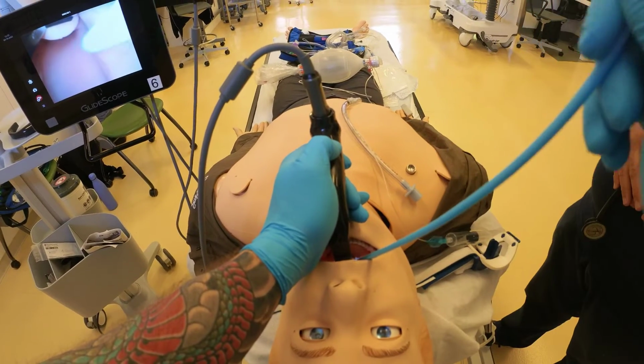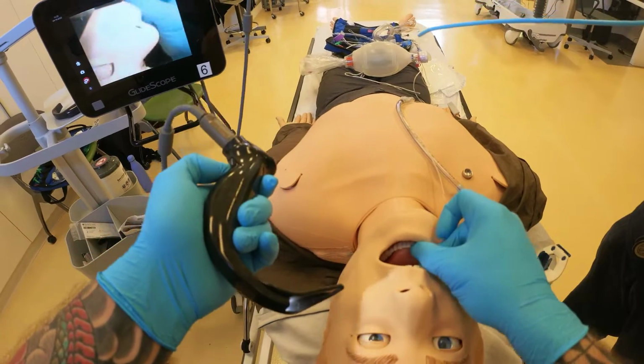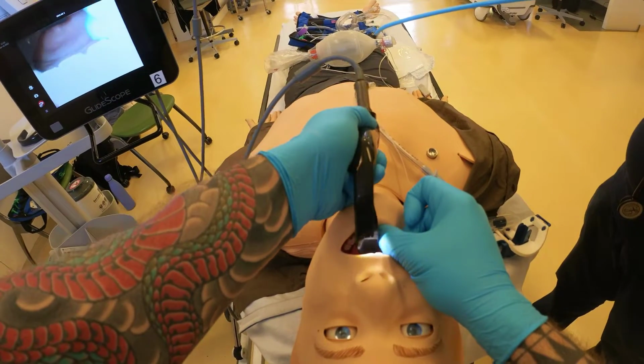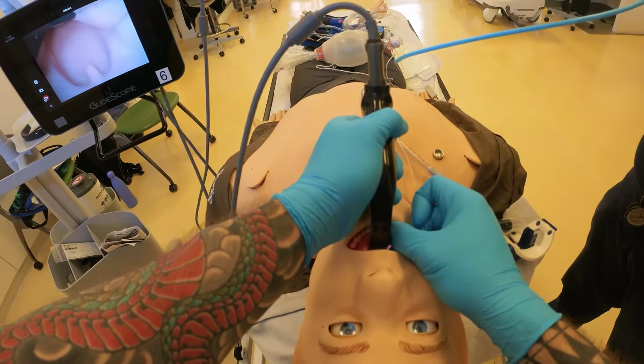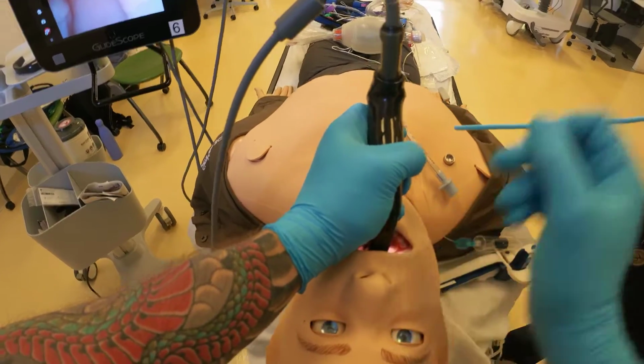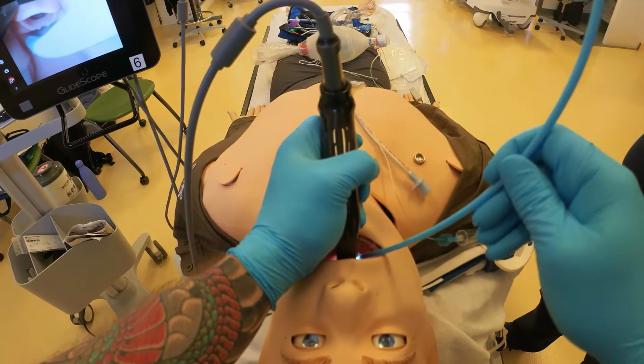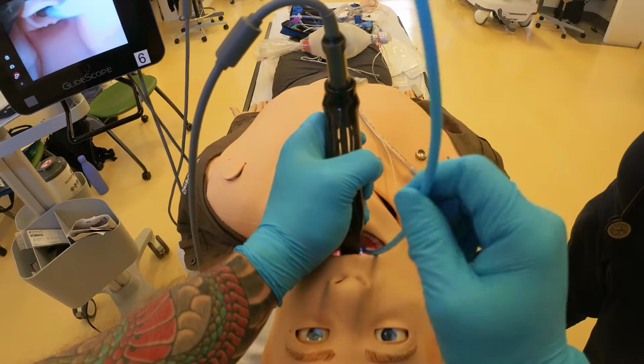So how this procedure looks from the beginning. So hold this for a second, right? Cross finger technique, right? Uvula, see it. Epiglottis is next. Set it into hyoepiglottic ligament. I see my interarytenoid notch. Bougie, Coude tip up, right? Come in, I saw it go in.